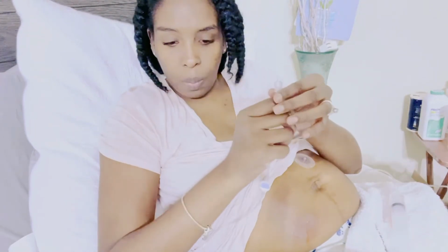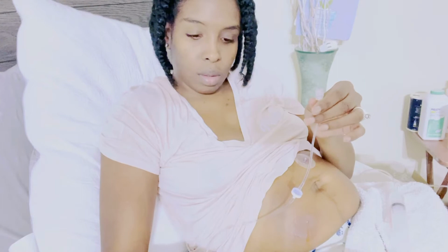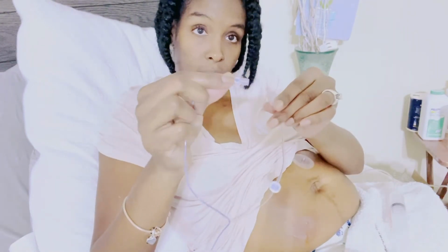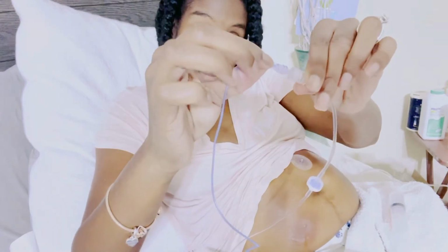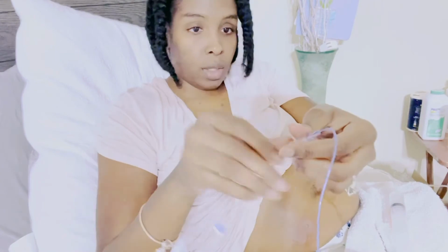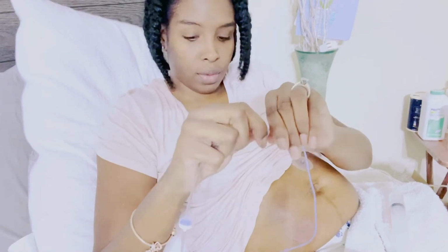Now, this part goes to the new tubing. You just take the new tubing and connect that there and twist those together.